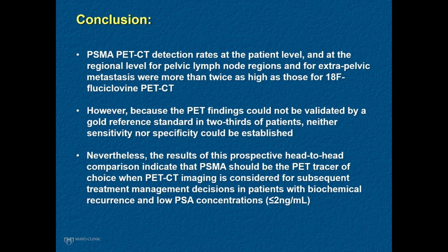So the take-home of this was that this is one of the earliest studies that supplanted other PET imaging, whether it's choline imaging, which I had a large experience in, or fluciclovine, in the evaluation of biochemical recurrence. And I certainly think that a PSMA PET is now the gold standard for evaluation, and it's fairly ubiquitous right now in the US. I will mention, just as both my colleagues have mentioned, that it's not perfect. These lesions that were detected, even though there's a higher detection rate, were not biopsy-proven metastatic sites.